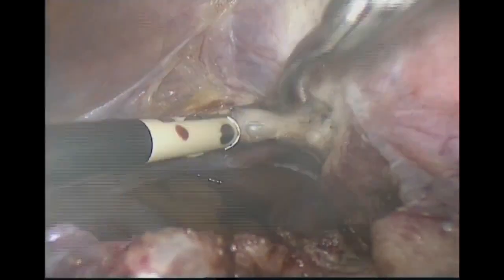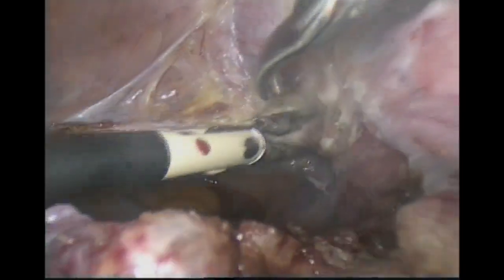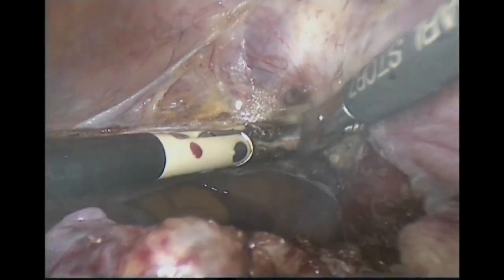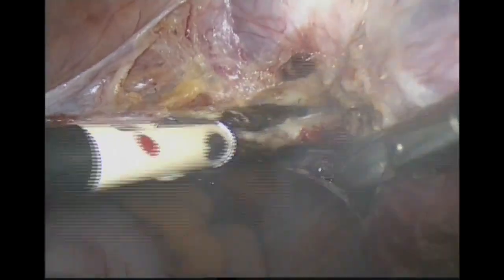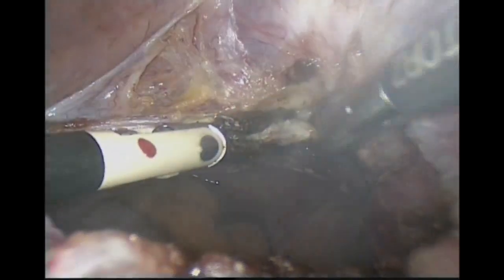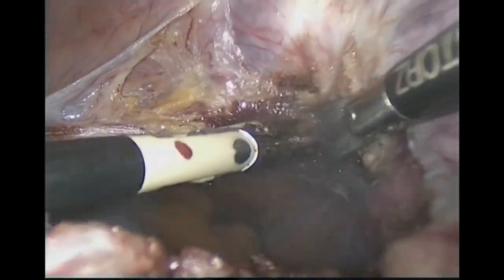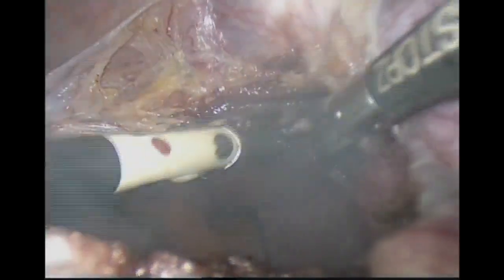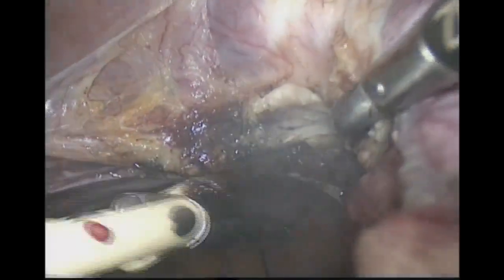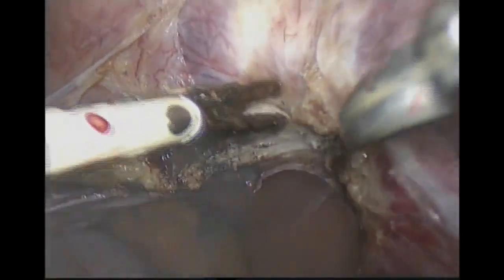Then go lateral to take all of the bladder fold. Then go shortly toward the lateral part of the uterus. It is very important to skeletonize the uterine artery, which is called skeletonization of the uterine vessels, and divide the uterine artery through the colpotomizer.